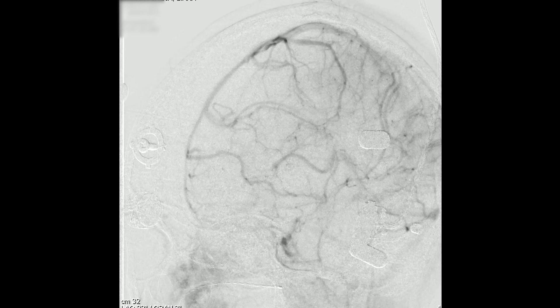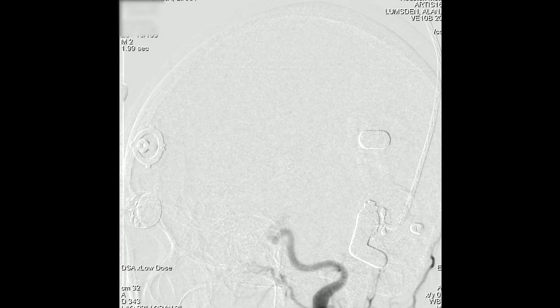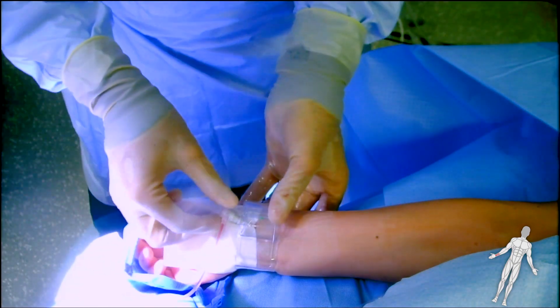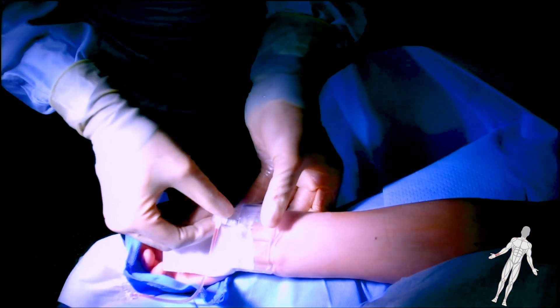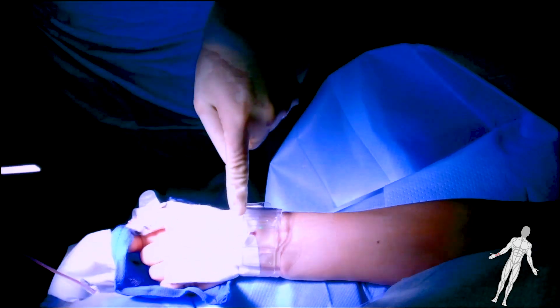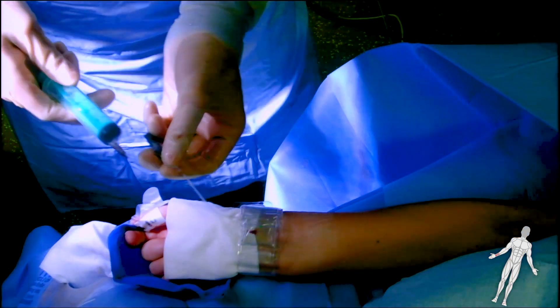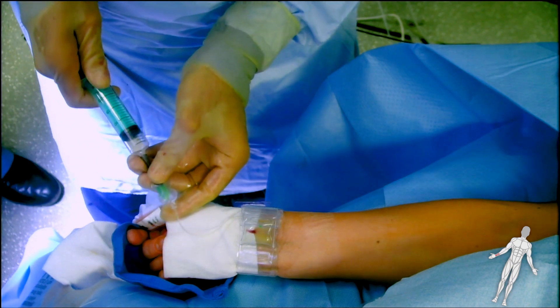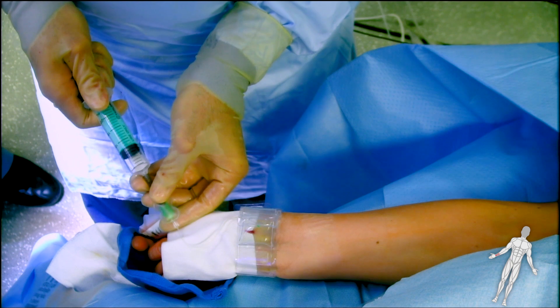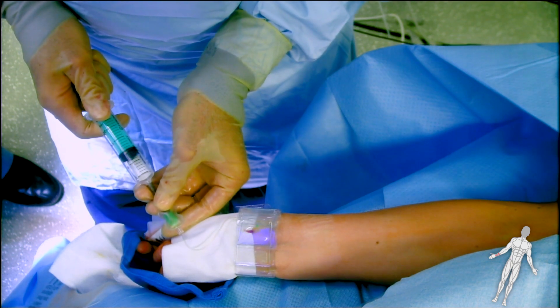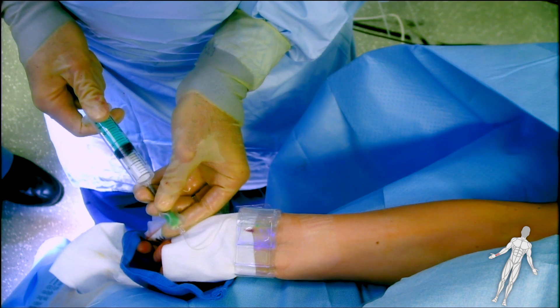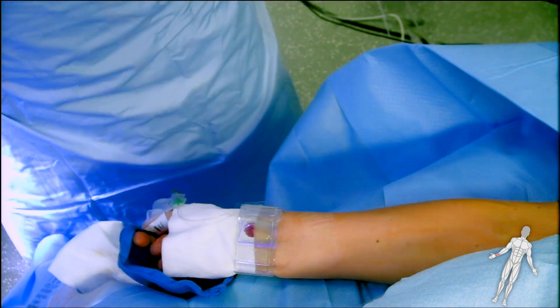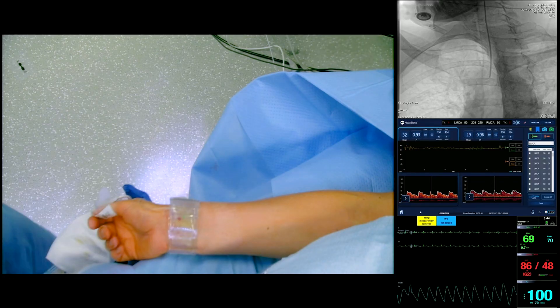Once we've completed this, it's really just a matter of pulling the catheter out and handling the radial artery in exactly the same way as we always handle radial artery access. Here you can see the pressure cuff has been inflated — you inflate it fully, then pull the sheath out. A nice little touch is putting a 4x4 underneath it so it's not all bloody. Then you back off the syringe — there's a one-way valve in that, you break it — and back it down until you see a flash of blood. Then put another two or three cc's of air back into it. You back it down, see the blood flush, then put three or four cc's back in and stabilize the cuff.